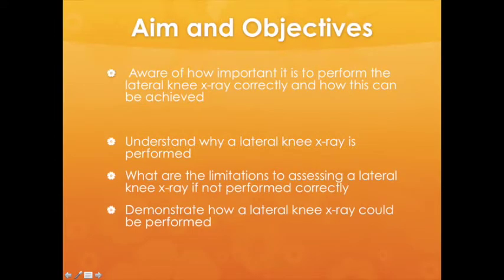The aim of this video is to make sure you are aware of how important it is to perform the lateral knee x-ray correctly and how this can be achieved. The objectives of this video will be that you will understand why a lateral knee x-ray is performed, what are the limitations to assessing a lateral knee x-ray if it is not performed correctly, and you'll be able to demonstrate how a lateral knee x-ray can be performed by the position shown.